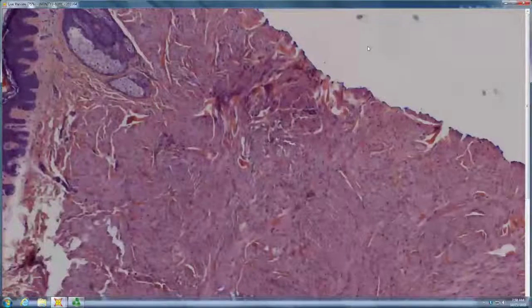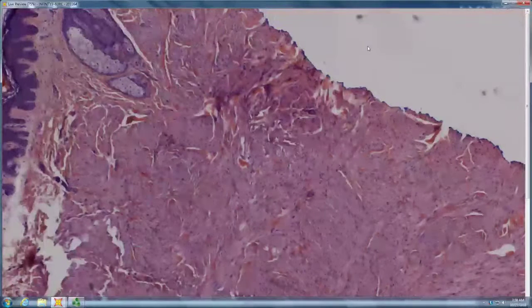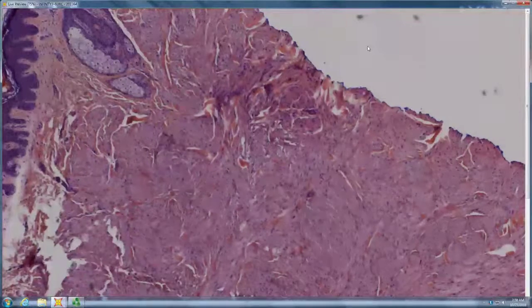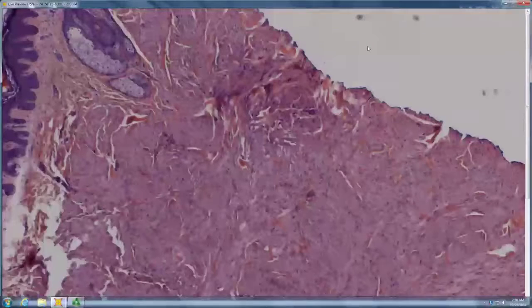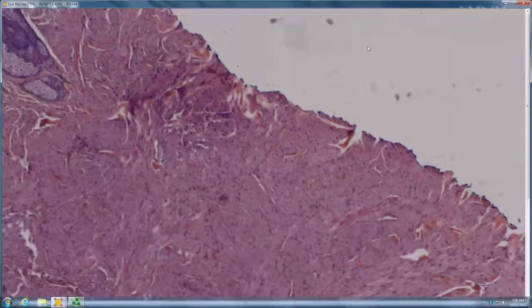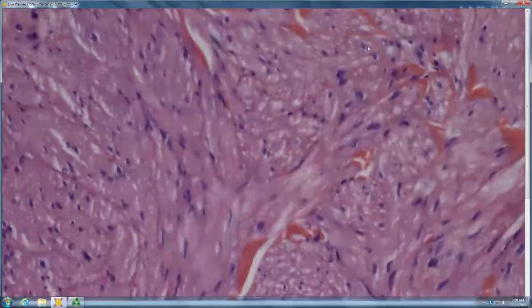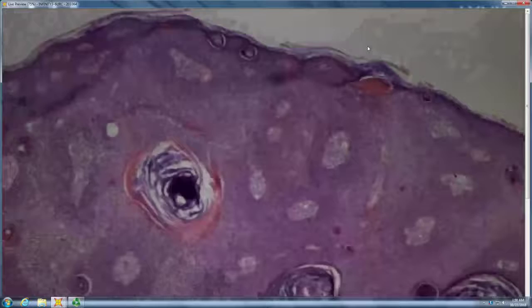That's a Tyler Volkmar mnemonic. You have in this case crisscross fascicles cut at various angles. Is that a good DMF, or is DMF more east-west? I think it's more east-west, so it's more like parallel. So this is more like piloleiomyoma, and then for confirmation, you look at your cross sections and look to see is there a little glycogen vacuole next to each of the nuclei. So piloleiomyoma, this is a patient with multiple renal adenocarcinoma. So that goes with fumarate hydratase deficiency and Reed syndrome.